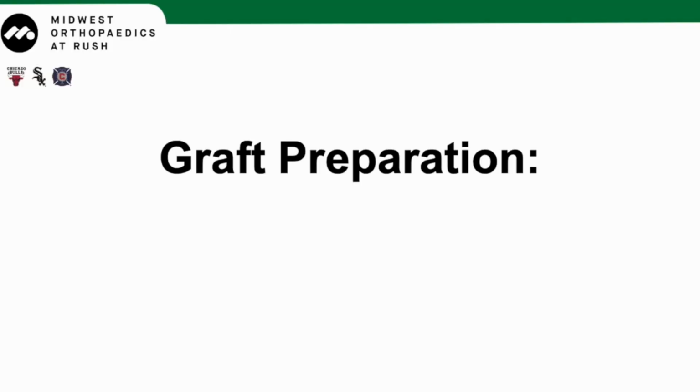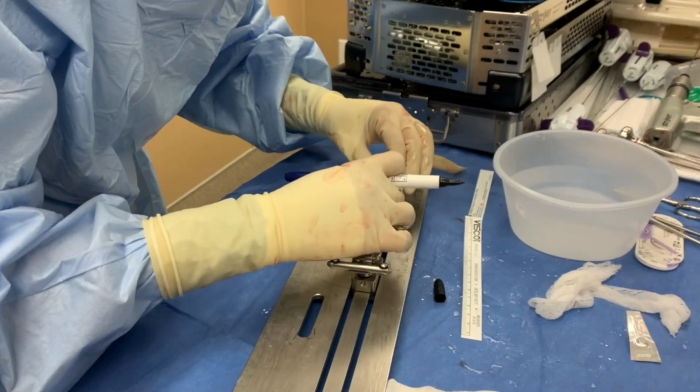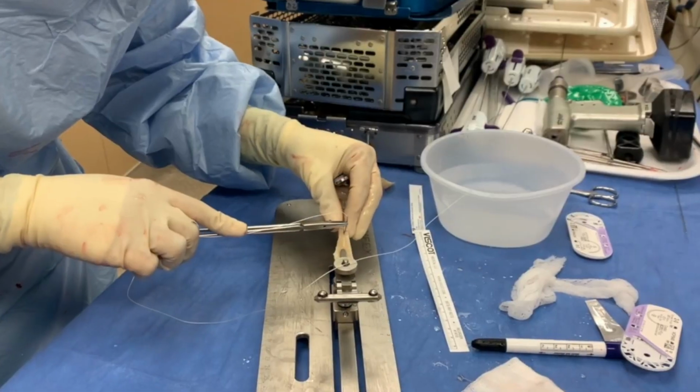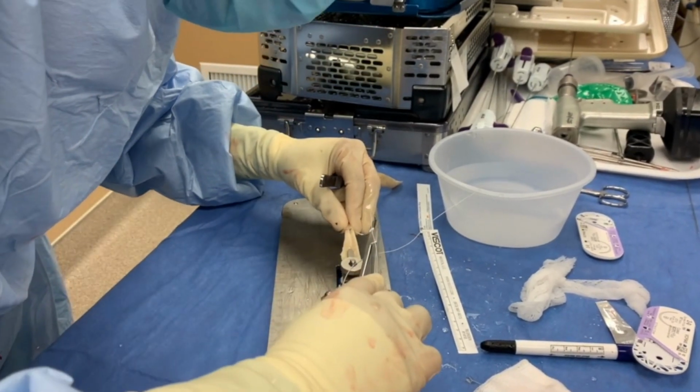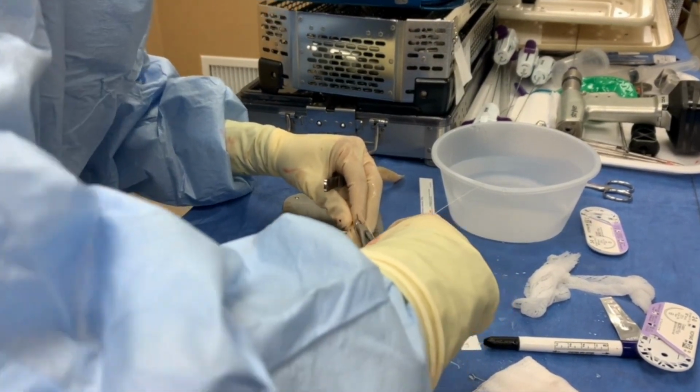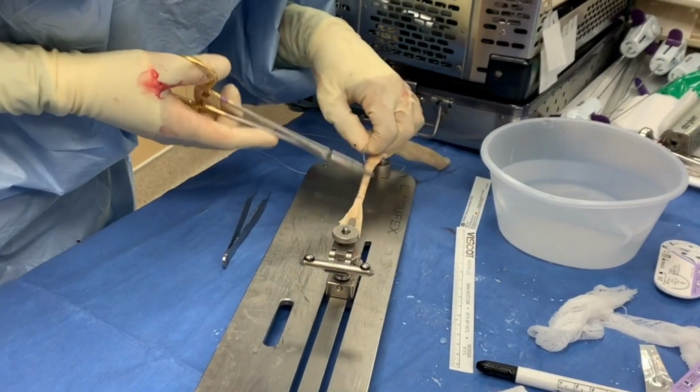On the back table, the tibialis anterior allograft was prepared for labral reconstruction. This was begun in parallel to anchor placement for labral reconstruction in order to lessen operative time. For graft preparation, we marked the central 65mm portion of the healthy and tubular aspect of the graft based on the measured size of our defect. A 3/0 Vicryl suture was then used to place a running stitch from one end to the other of the marked portion of the allograft.